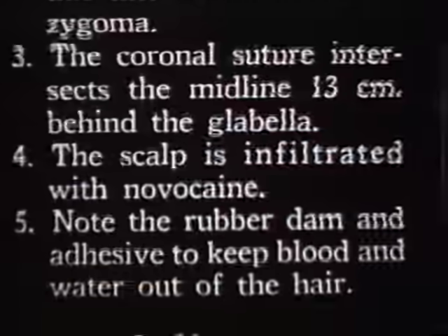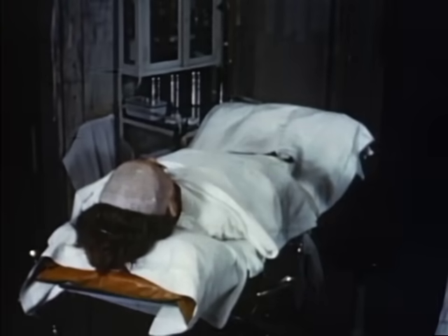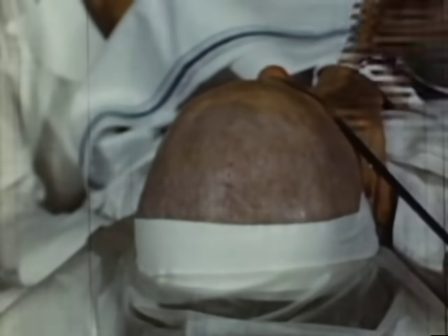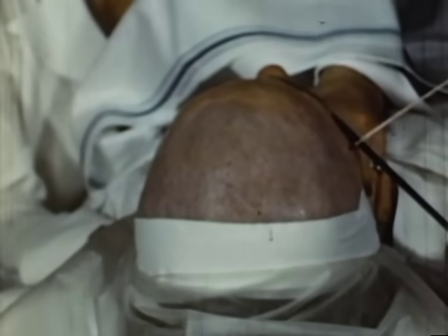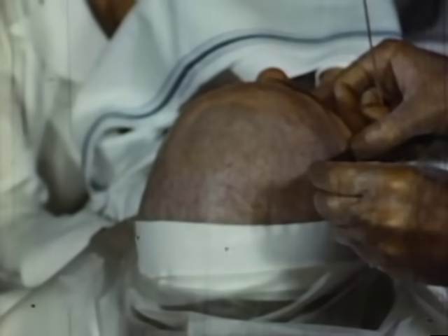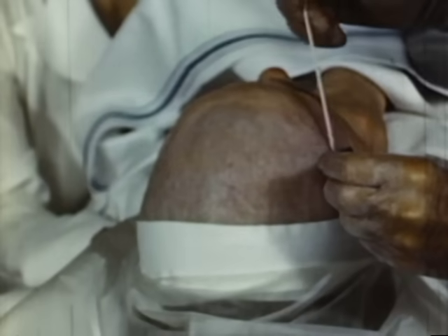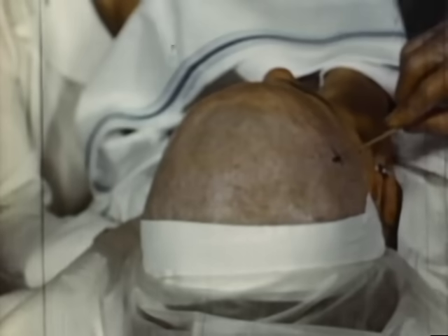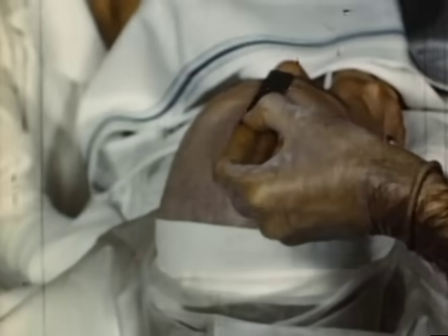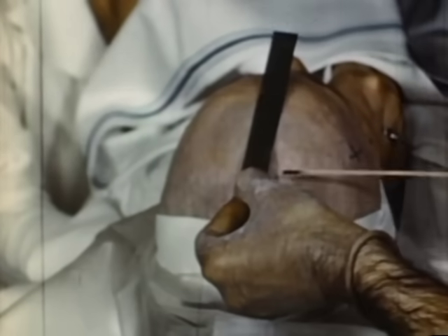The patient is lying on the table with his head shaved back as far as the vertex. The first mark is made three centimeters behind the lateral rim of the orbit, and then a cross mark is made six centimeters above the zygoma. Another mark is made in the midline, 13 centimeters from the glabella.